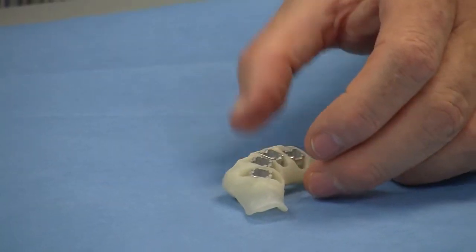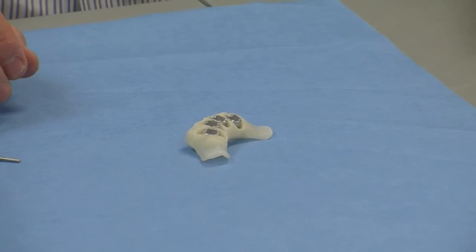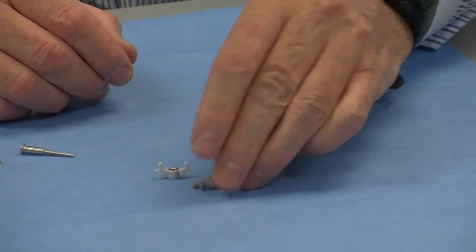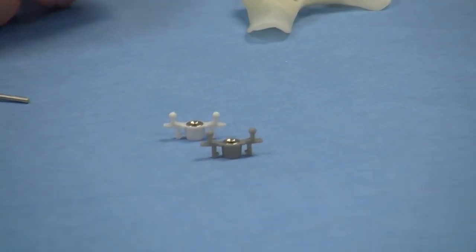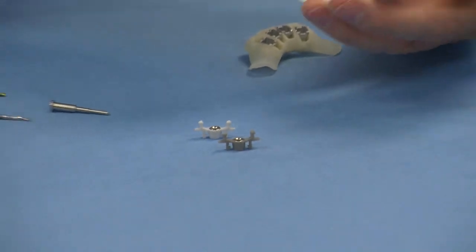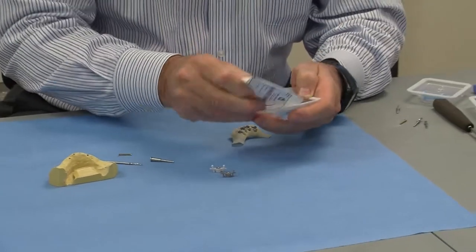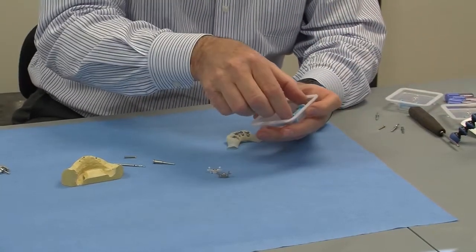The guides come for the mini implant in two sizes: the light gray or the dark gray guides. The guides are coming in a sterile blister, which is opened very simply. Each box has one guide and one carrier.